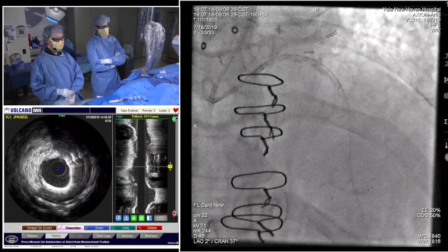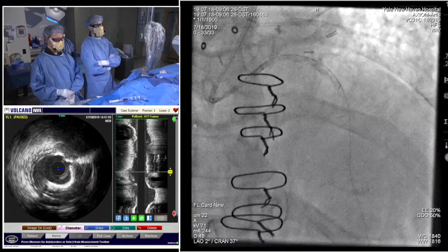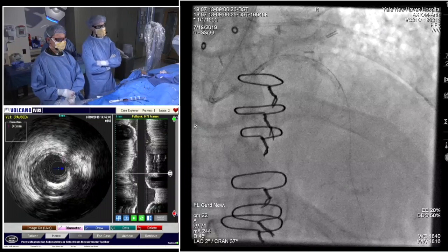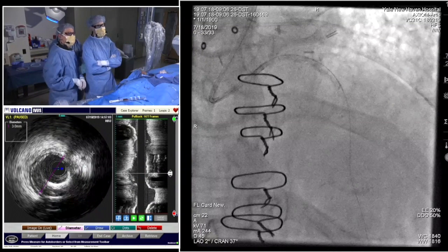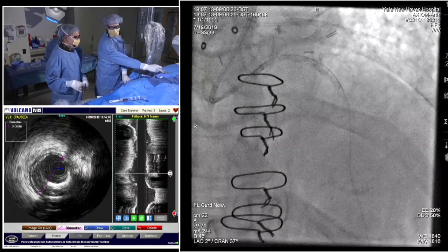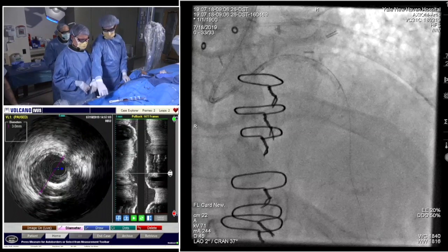The other challenge here is that it depends on how far proximal you're going to get, but if you take a 2.75 stent, it may not get, depending on which stent it is, all the way up to where you need it to be in the very proximal LAD, left main. So there are stent sizing charts and things like that you can sort out. This looks more 3.0 in this segment. And remember, she's immunosuppressed and small, so you might want to choose to go more size that way rather than go too big. So what were you thinking size-wise?